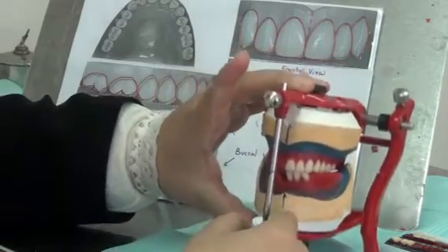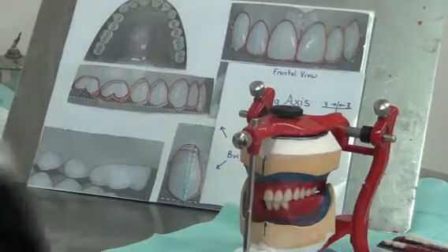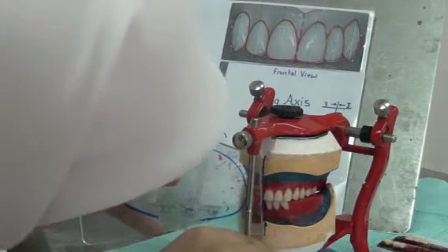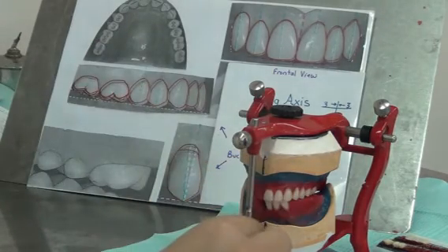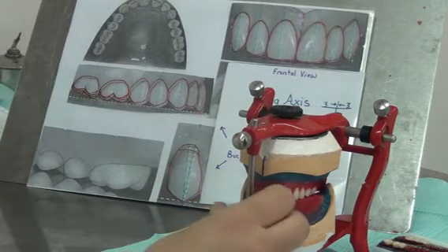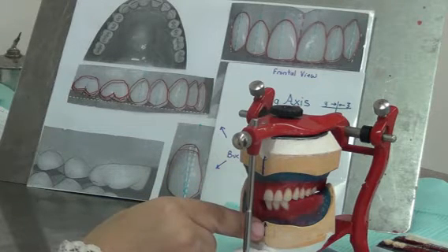I also check the midlines. So we can bring a ruler and check that the cast to cast midlines are coinciding with the teeth. The incisal pin should have been used in the articulator, but you might have some problems with your articulator. We just want to make sure that the cast to cast midlines are coinciding.